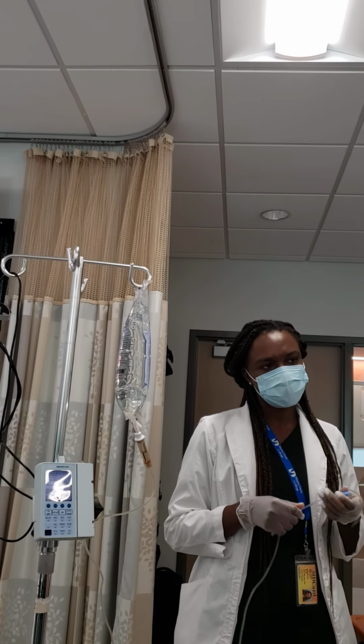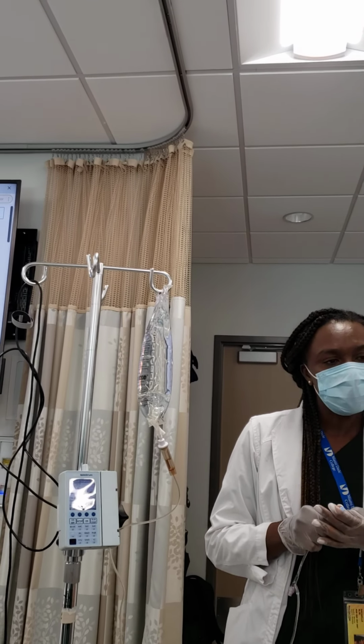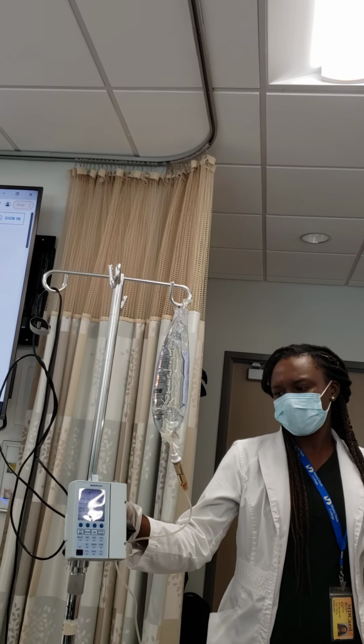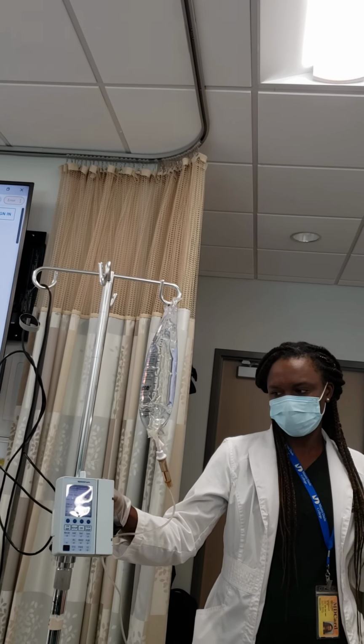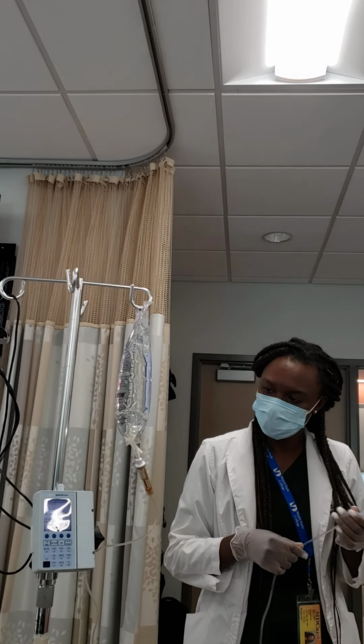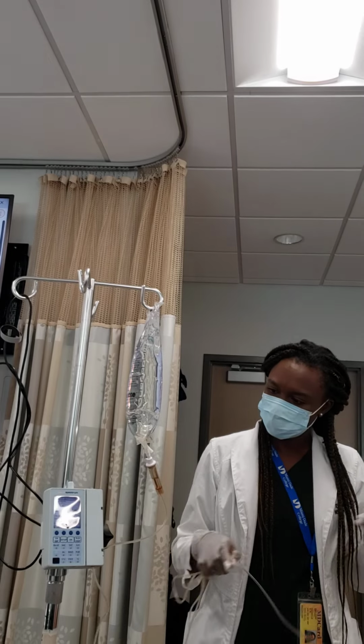Do we need the label? The label tape? Yeah, the label. You don't have labels there, so I can't really tell you how to put them, but you'll have to verbalize it. You put the labels around the bottom of the chamber, right? We put the label on the top.